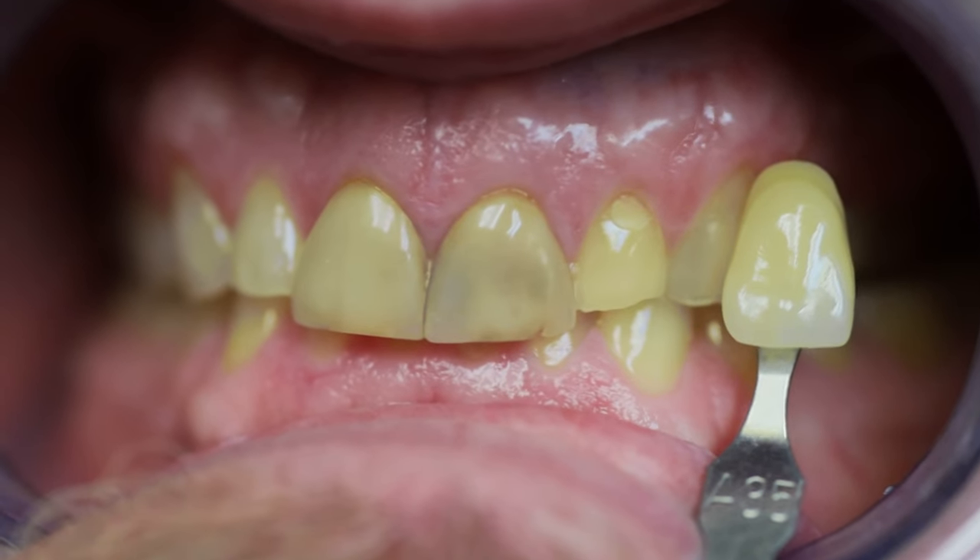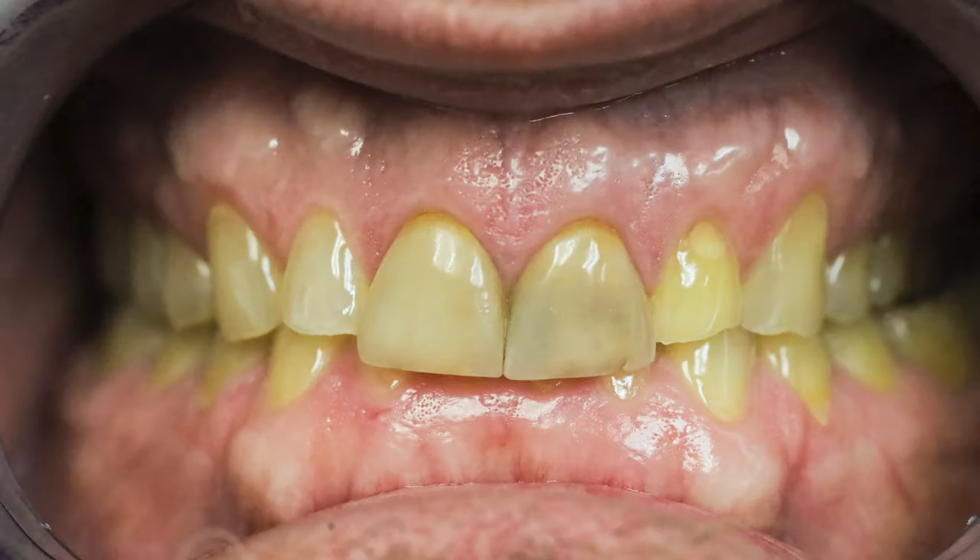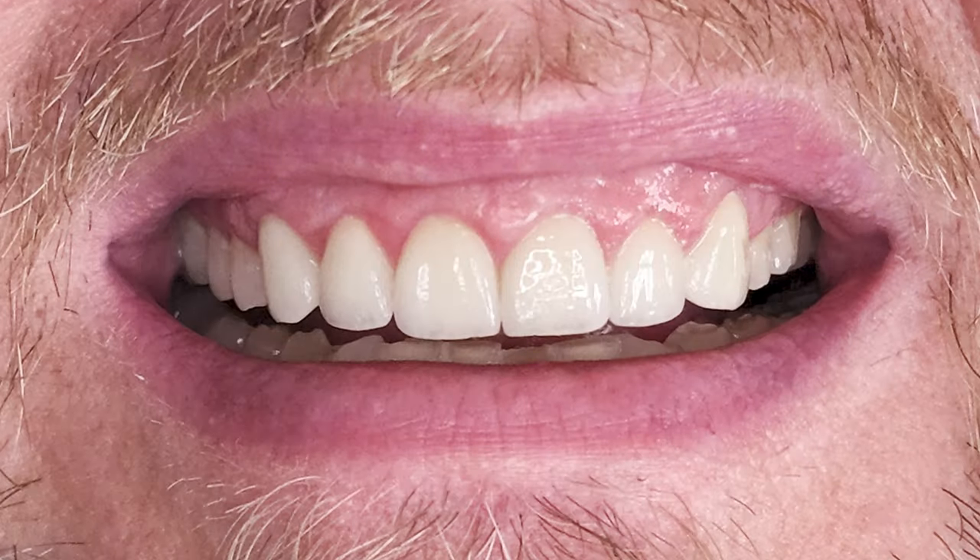I'm Rick Buck and I've been a dentist for 15 years. This smile here today is the canvas that I have to begin with, and I'm going to show you everything that goes into transforming it into a beautiful smile.